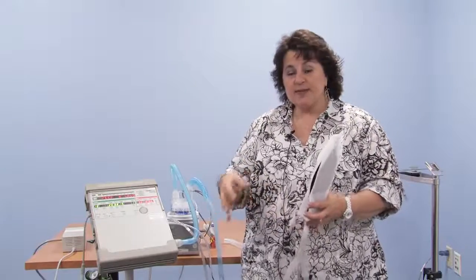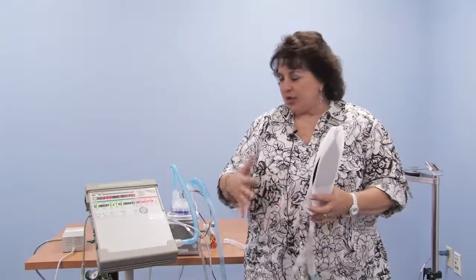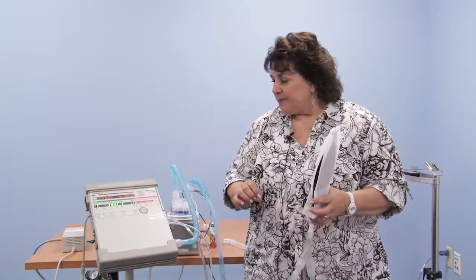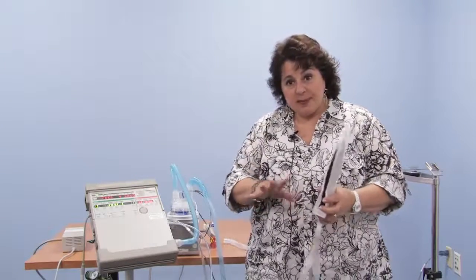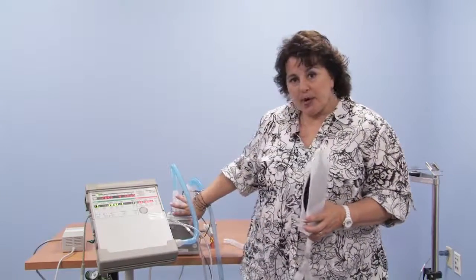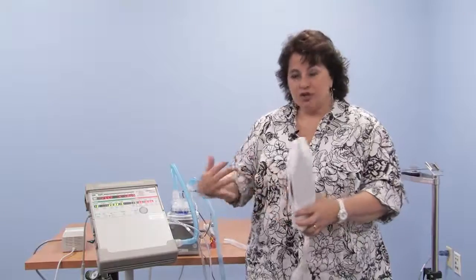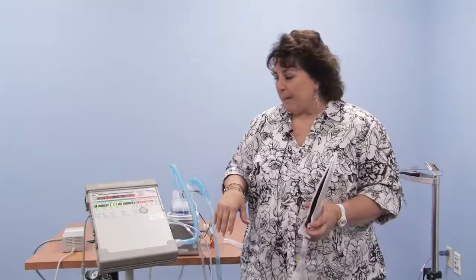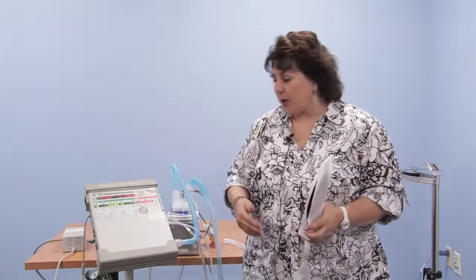And the PEEP setting is done when you first put the circuit on the machine, when it comes out of the package. No one's going to ask you to chase the number if it says 4, 4.5, 5, 5.6. We just want it to be close to 5. And the circuits, it depends on your DME company, but most recommend the circuitry being changed every 2 weeks, including humidifier parts. So every 2 weeks when you change the circuit, if your child's on support 24 hours a day, you'll use your backup ventilator and change the ventilator circuit that has the most parts, which is the one used with humidification, and then test it, which we'll show you as well.